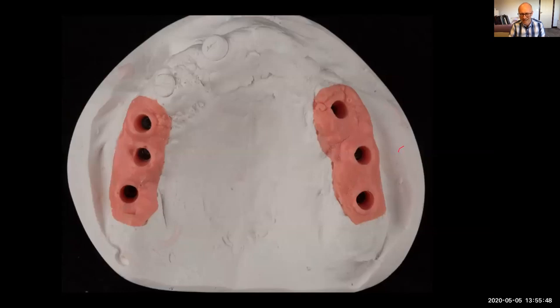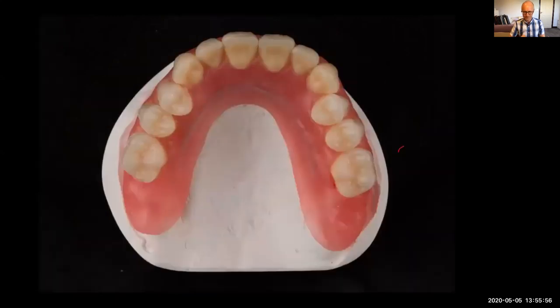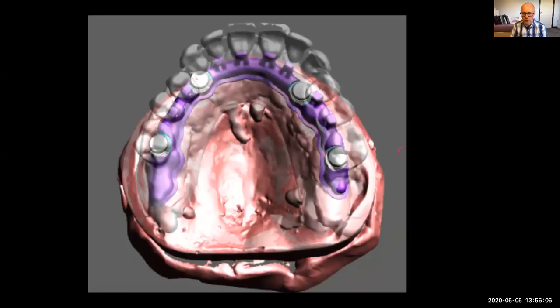So we've got this as an analog here. This is an analog of the mouth with soft tissue, definitive cast, and then a try-in. So that's an exact copy of the Mark II denture she's wearing. We then send that over to Spain, which is Createch. It's part of Straumann. So this is the company that we use for our bars, Createch. So that goes over there.